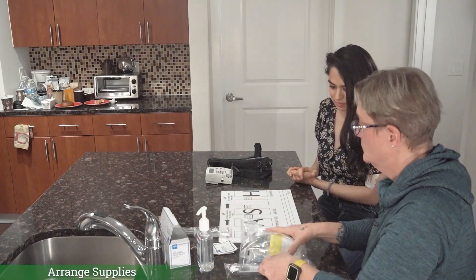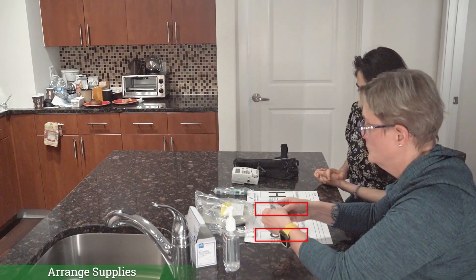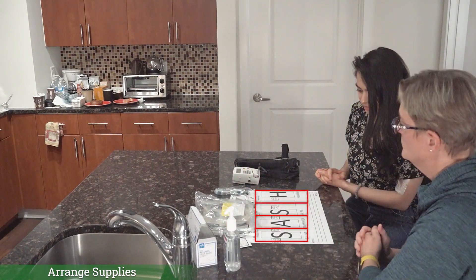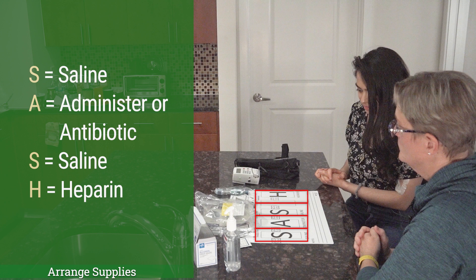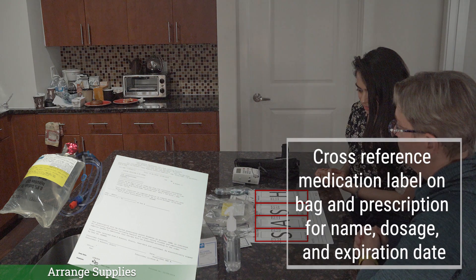Arrange your supplies on your clean sash board according to the steps on the board. Place the alcohol pads in their place on the board. Place a saline syringe over each S. Place your medication bag over the A. If flushing with heparin is prescribed, then place a heparin syringe over the H. S is for saline. A is for administer or antibiotic. The second S is for saline. And the H is for heparin, if needed. You will also need the most recent medication orders from your home infusion provider.